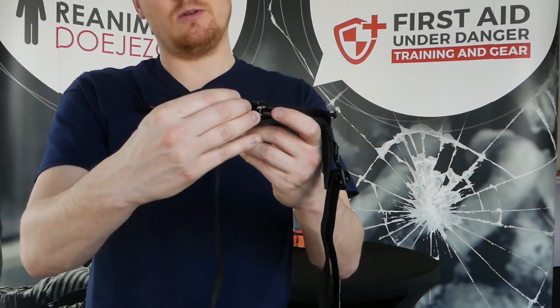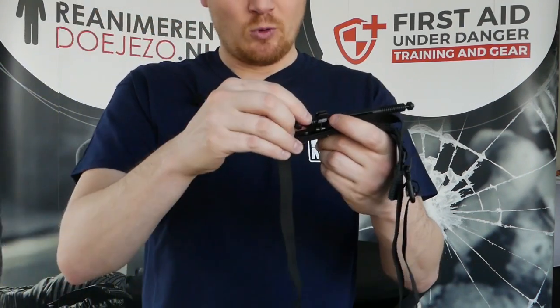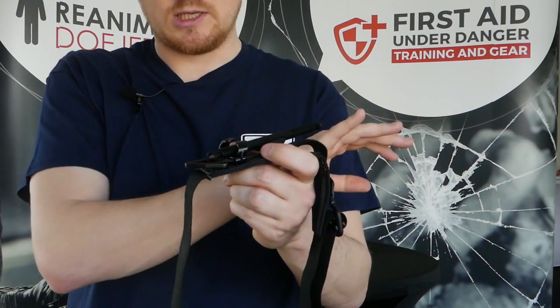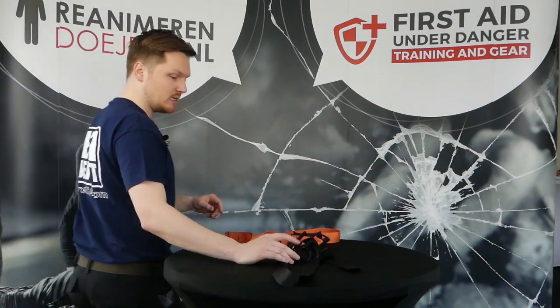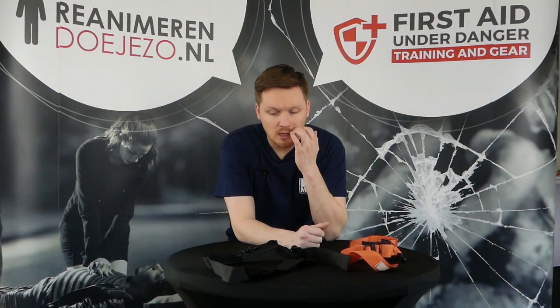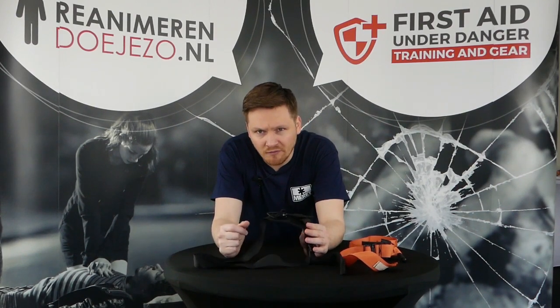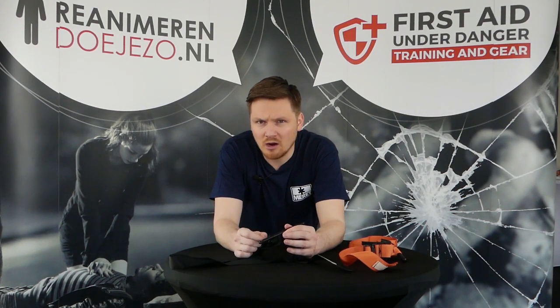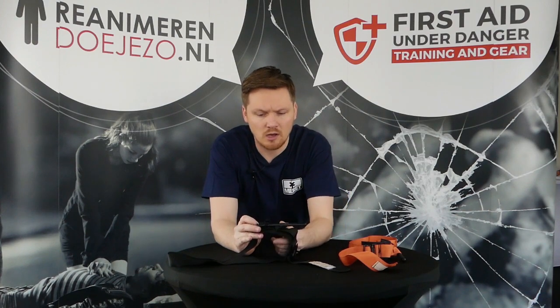But what I do miss, because they probably still want you to also put it in a triangle, what I still miss is a way to close this off, to make sure that it doesn't get out if somebody touches it, because there is a lot of tension on a tourniquet rod. And this isn't plastic, this is airplane aluminum, so it's very sturdy. It probably won't bend because it can handle a lot more pressure, but that also means that if this snaps out and your finger is still in the way because you cannot secure it, it might be dangerous for your fingers because this is really hard and it could potentially break your fingertip if you get in the way as soon as it tries to unwind.